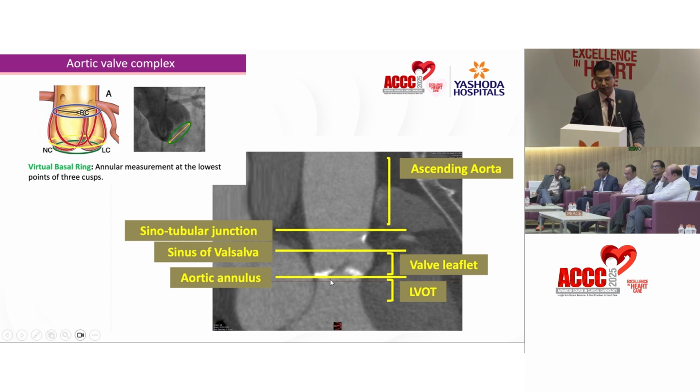We need the aortic annulus, we need the STJ height and the sinus of Valsalva diameter, we need the ascending aorta dimensions, we need the leaflets, we need the coronary ostia, and these things determine what valve, what size, and what complications or challenges to expect.